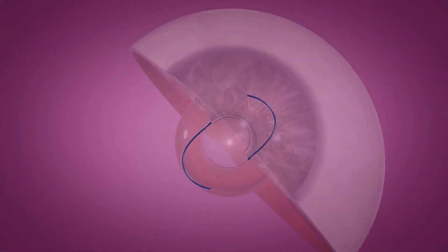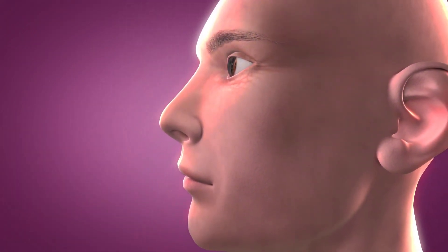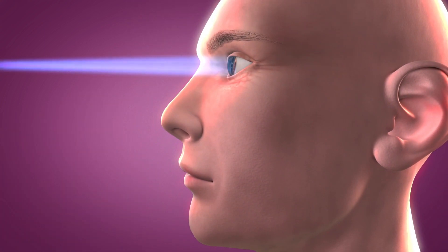RxCite's Light Adjustable Lens provides cataract surgeons with the ability to adjust the power of an intraocular lens after the lens has been implanted and the eye has healed, with an in-office, approximately 40-120 second light treatment.